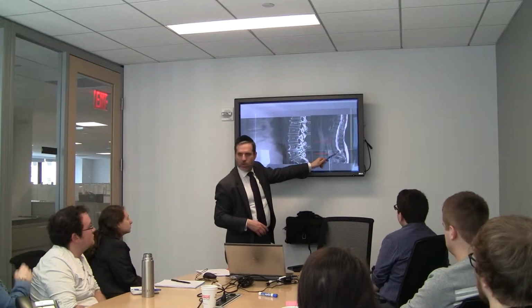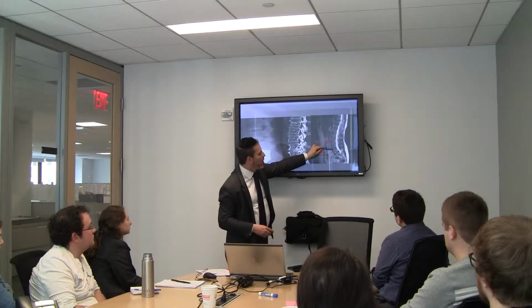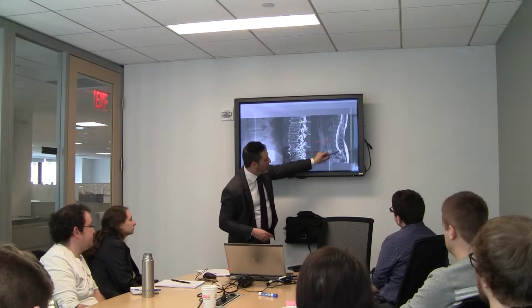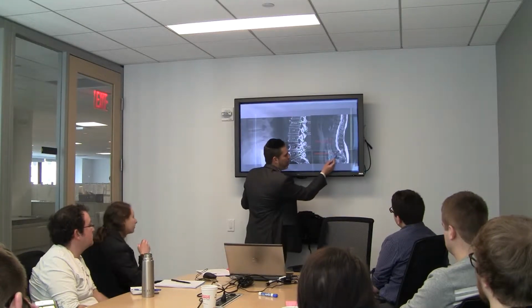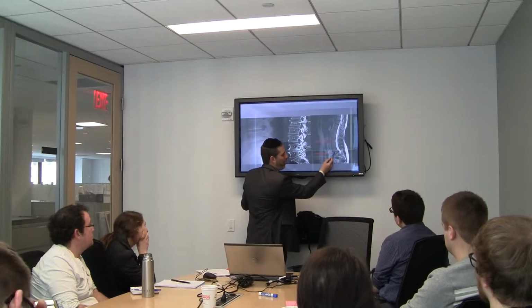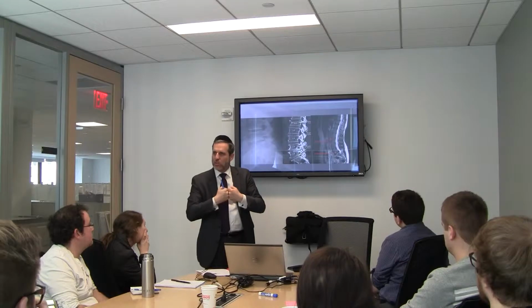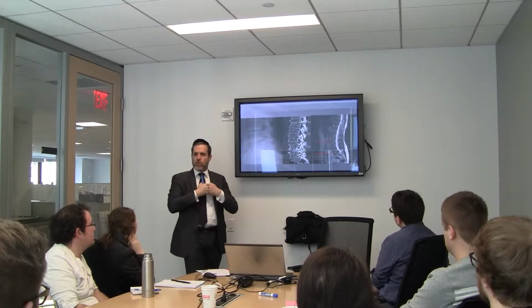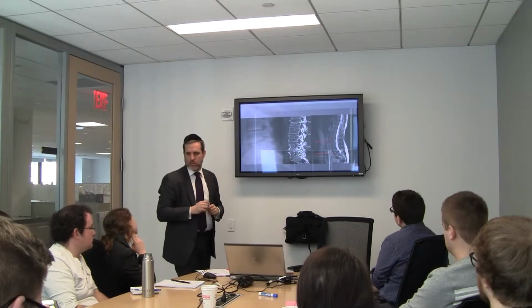And look at that degenerative disc here. You're seeing good disc height, good disc height, excellent disc height, and then almost no disc. The disc that is there is black, it's collapsed, and look what's happening to the bone. You see that white character there? That means that the bone is losing the impact of that shock absorber. It's starting to react one to the other, so you're seeing a lot of detail here.